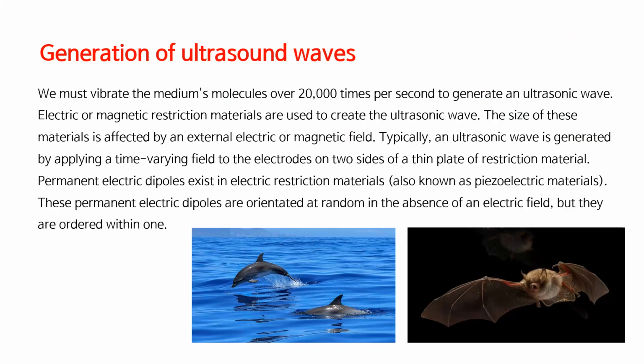Now let's see how ultrasound waves are generated. We must vibrate the medium's molecules over 20,000 times per second to generate an ultrasonic wave.